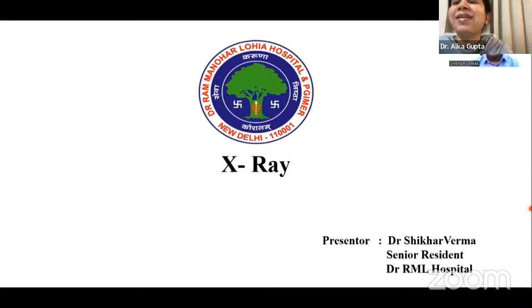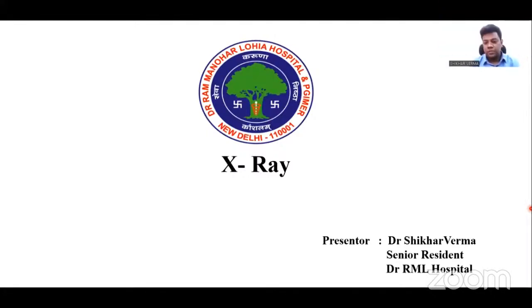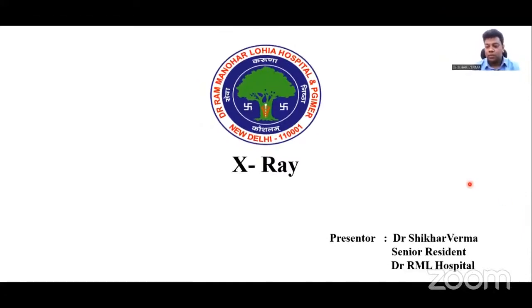In RML Hospital. In this video, we shall be studying the basics of X-ray, the systematic approach to diagnose any pathologies in the X-ray, and the various films which you can encounter in the exam during your PG examination. So friends, let's go and study about the X-ray.